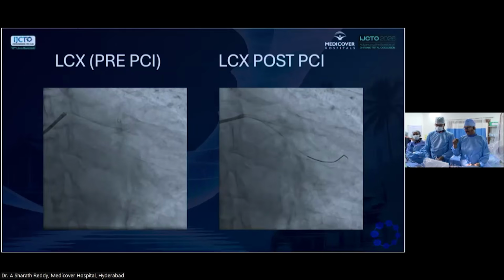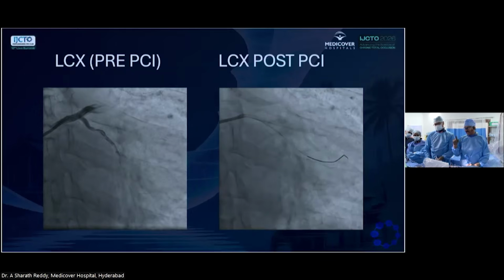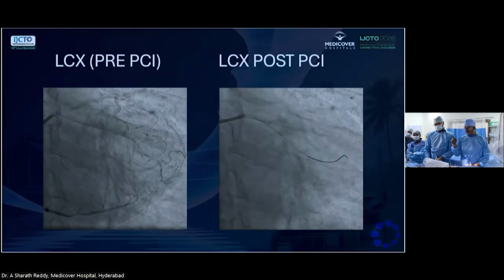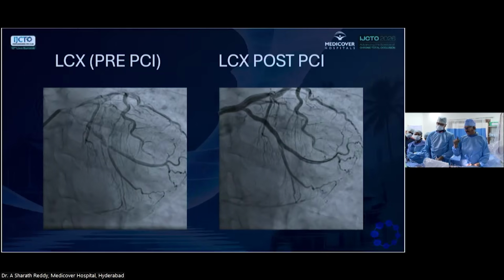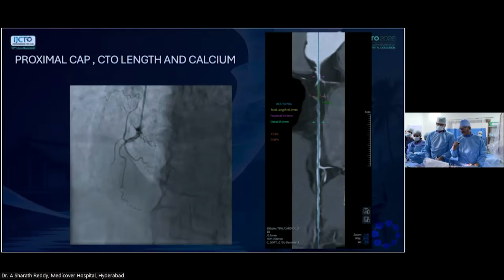This LCX was treated during the index presentation. This is the LCX result, which is pretty good. Next. And for today's analysis, you can see this is the proximal cap, which is quite ambiguous.